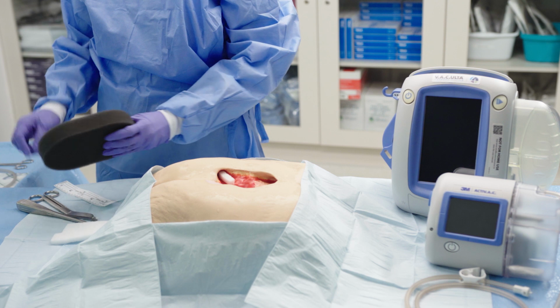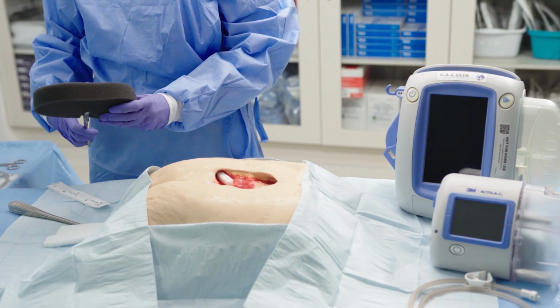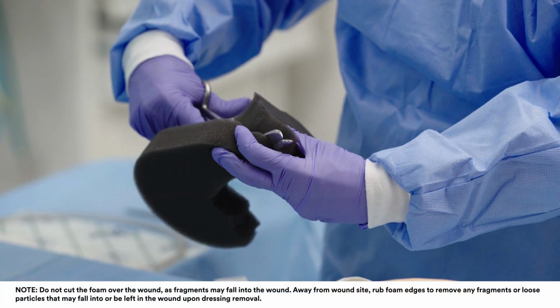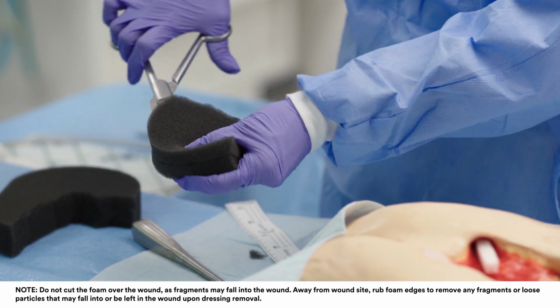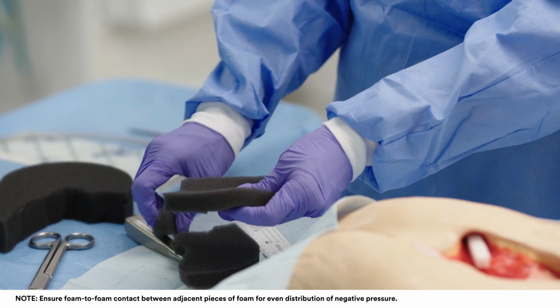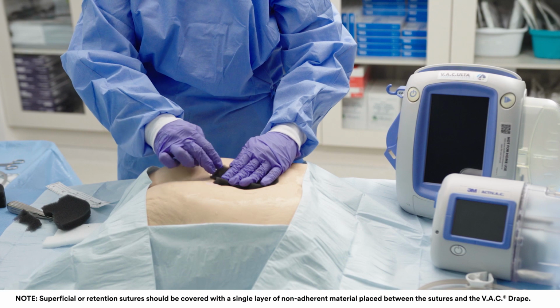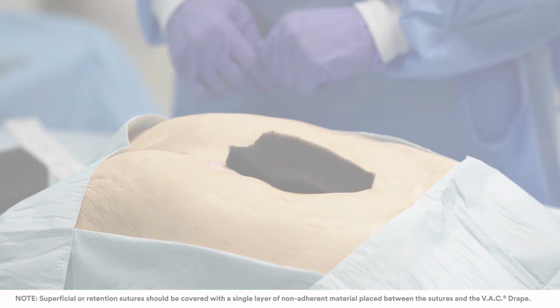Cut the foam dressing to dimensions that will allow the foam to be placed gently into the wound without overlapping onto the skin. Gently place the foam into the wound cavity, ensuring contact with all wound surfaces. Do not force foam dressing into any area of the wound.